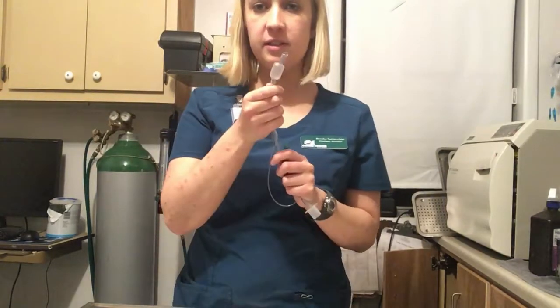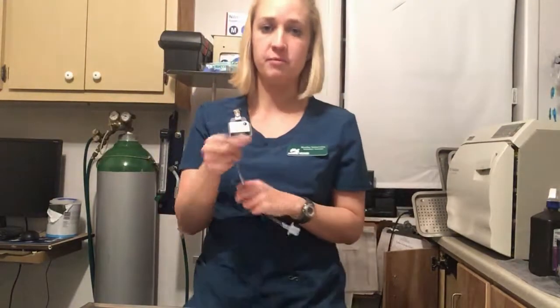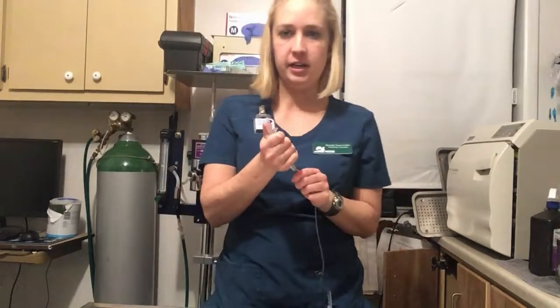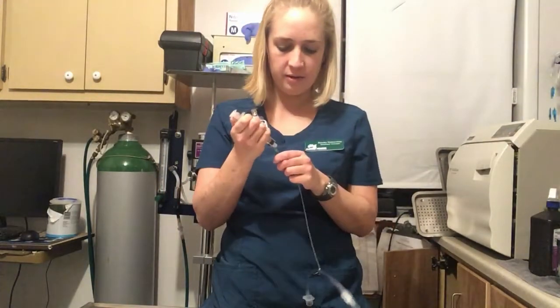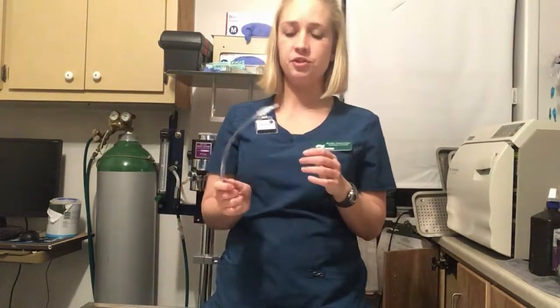Now that it is inflated, you can manipulate it and make sure that none of the air escapes from your endotracheal tube. Then you can go ahead and deflate it before inserting it into the trachea.